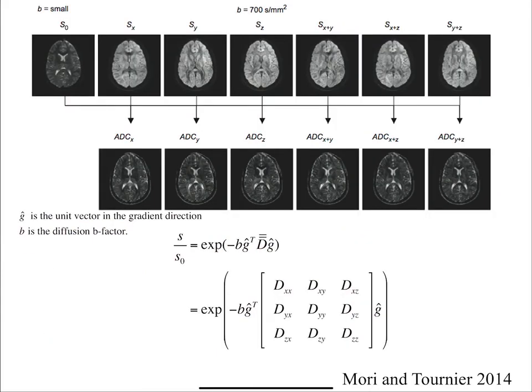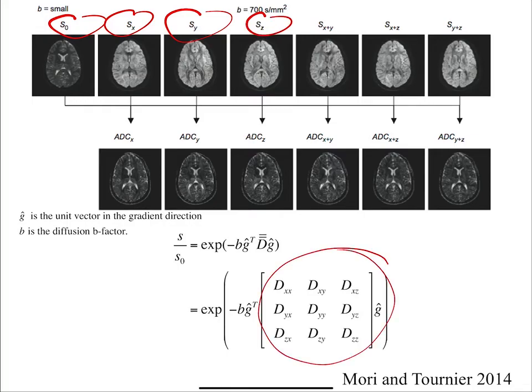Okay. So these are actually the images I had in exercise 3. So that's where these images are from. Typically we have these images acquired at different directions. Each of these goes into making our diffusion tensor image, and that's what we're trying to estimate. So this is what we measure, and from those measurements we try to estimate our diffusion tensor.